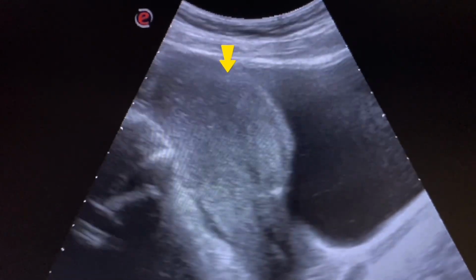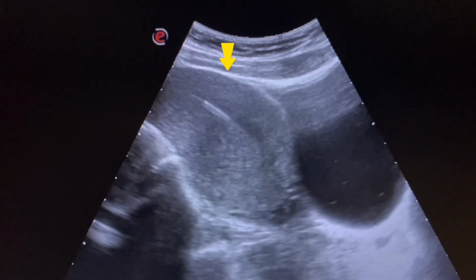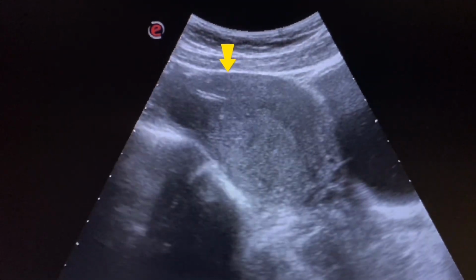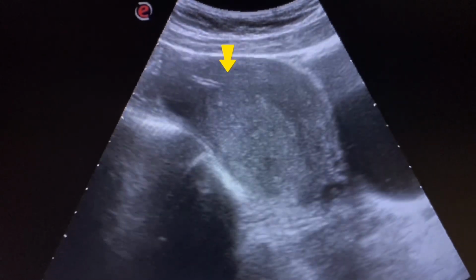So the device is placed in an improper place, with injury of the muscle layer of the fundus and collection of fluid which is blood. Now how we will write the report.